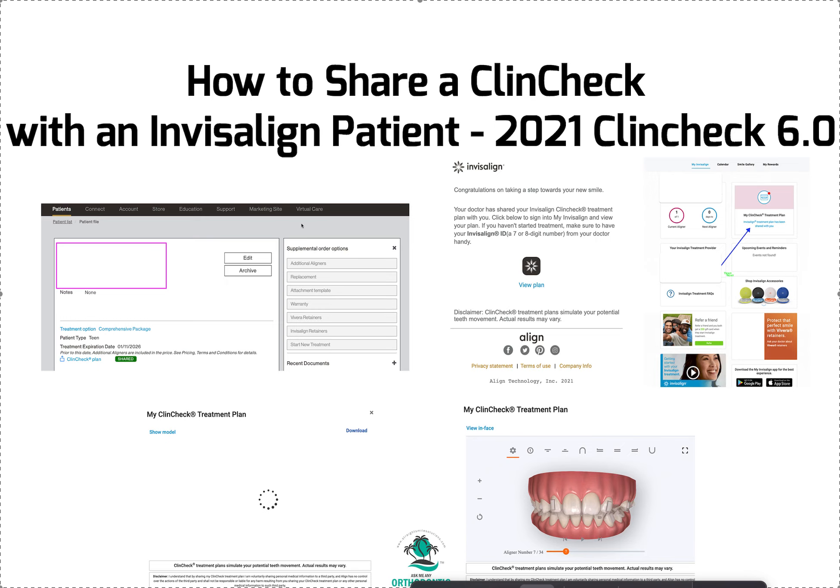The first thing your patient has to do is either download the app or set up an Invisalign patient account on the Invisalign website. I already had an account so it was easy for me, but I think in order to have the account you need to download the app on your phone. Just FYI, that could be something you do first.